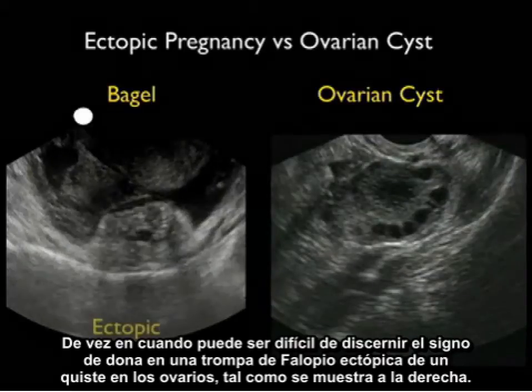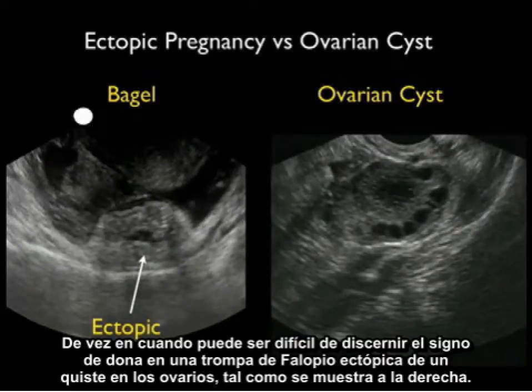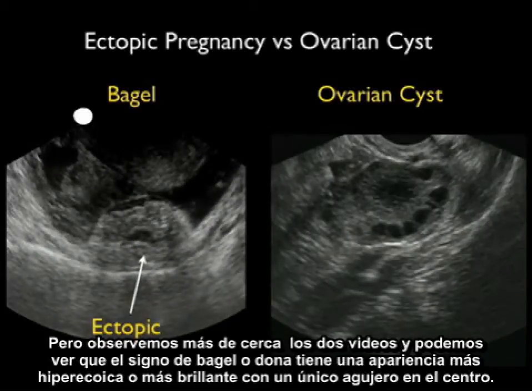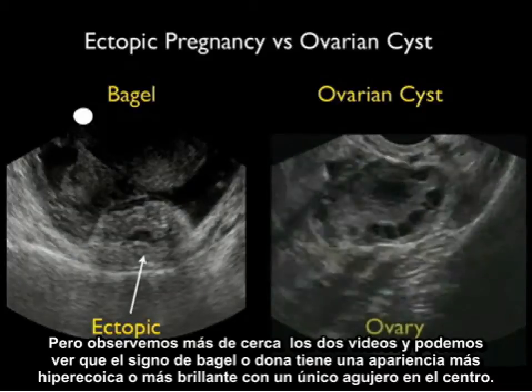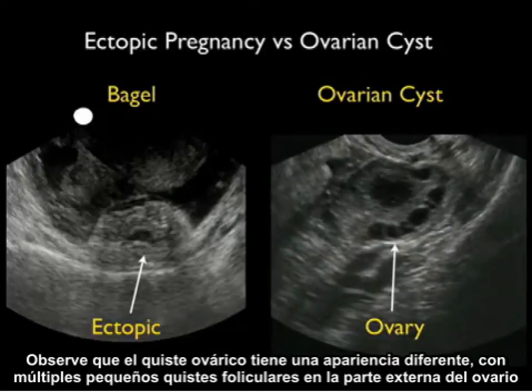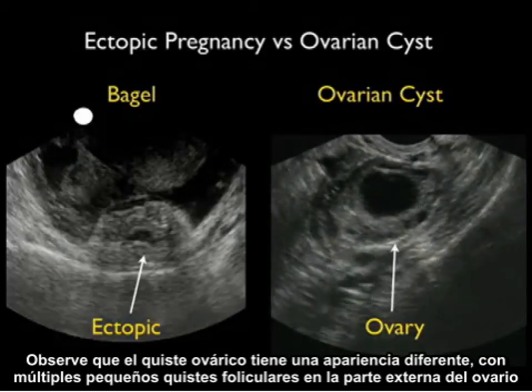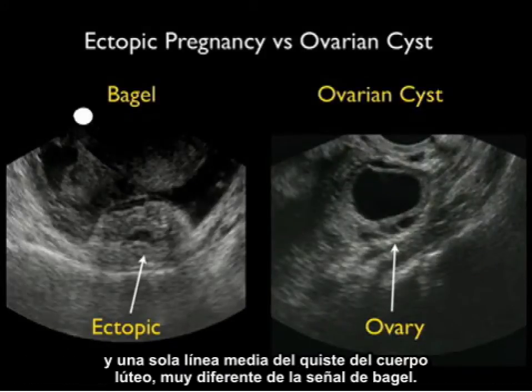Occasionally it can be difficult to discern the bagel sign of a fallopian tube ectopic from an ovarian cyst, as shown here to the right. But looking closer at the two video clips, notice that the bagel sign has a more hyperechoic or brighter appearance with a single hole in the middle. Notice that the ovarian cyst has a different appearance with multiple small follicular cysts to the outer portion of the ovary and a single midline corpus luteum cyst — very different than the bagel sign.